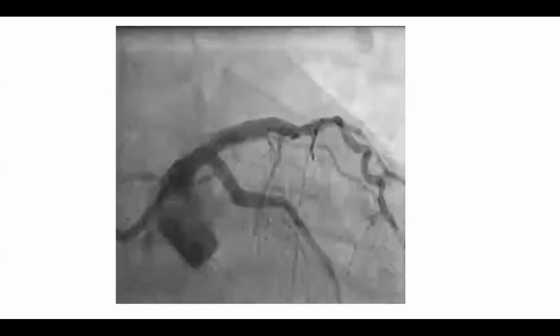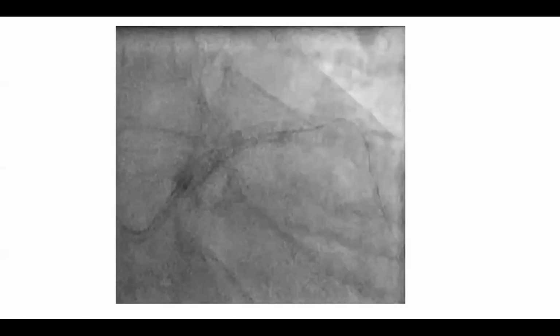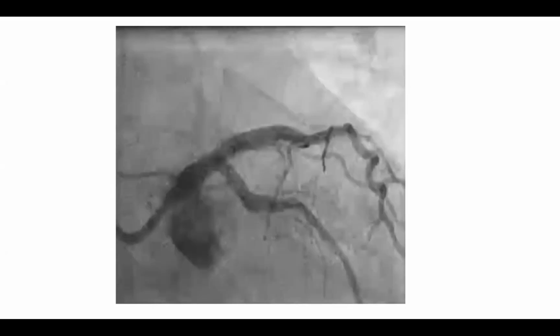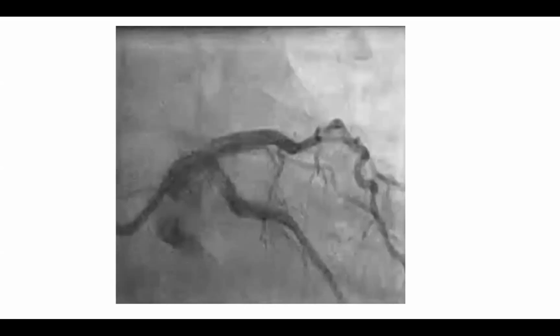And then nicely, I think that's also a good point that he did in the left main with a circular balloon, because there is very limited data, but if you use one larger balloon rather than 2 balloons, you get better circularity of the vessel. Very good case indeed. A beautiful result.